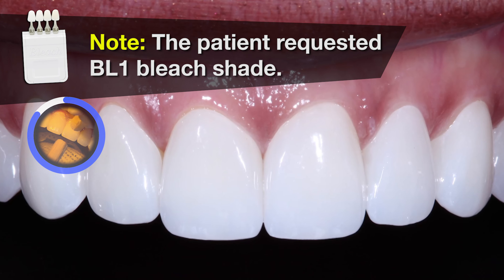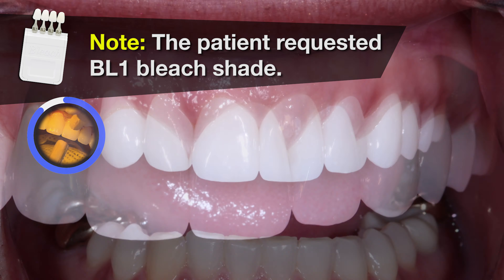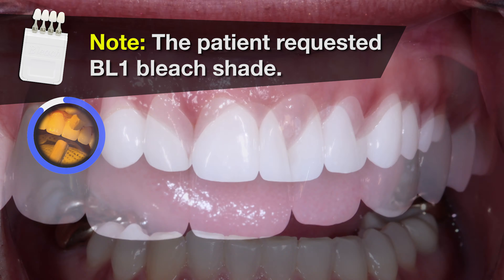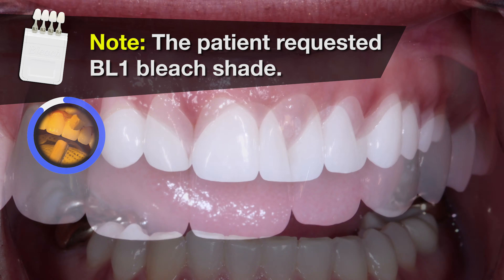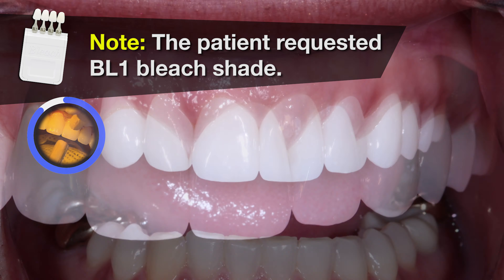Now I seat each restoration with KERS NX3 Universal Resin Cement. I like using this cement for its handling properties and the fact that it's light-cured to set. Since it's a light-cured cement, it offers unlimited working time, allowing me to seat all of the restorations at the same time.